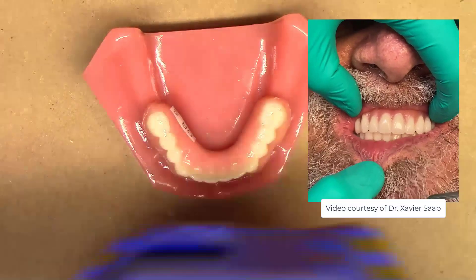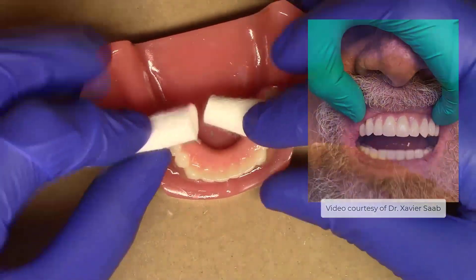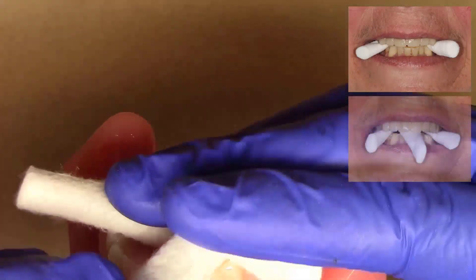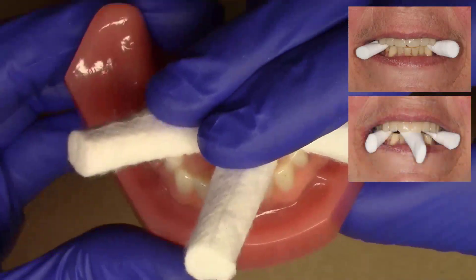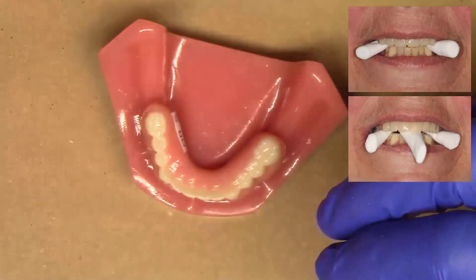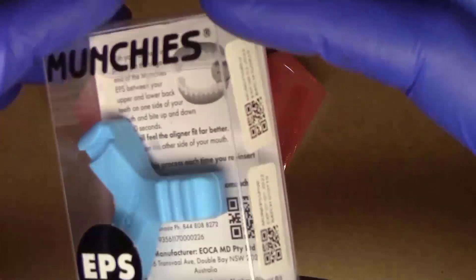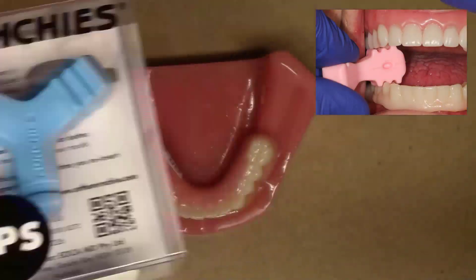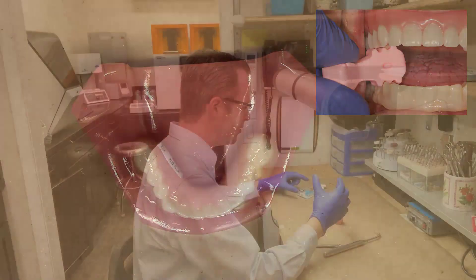You can also have the patient help by using a couple of cotton rolls in the posterior, or you can add a third cotton roll to the anterior, so that when the patient bites down they're making a tripod formation. Additionally, if you have any orthodontic chews, you can take an orthodontic chew and have the patient bite down on it to help seat the prosthesis.